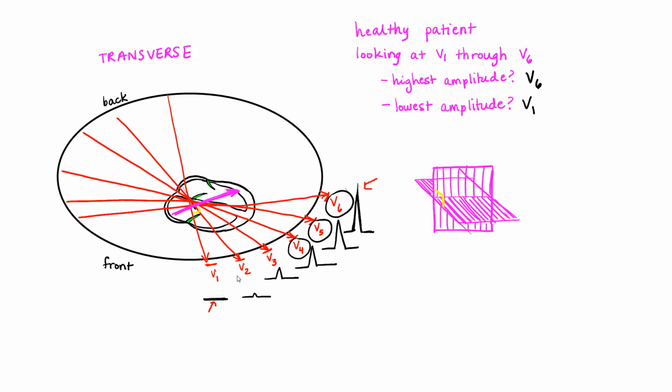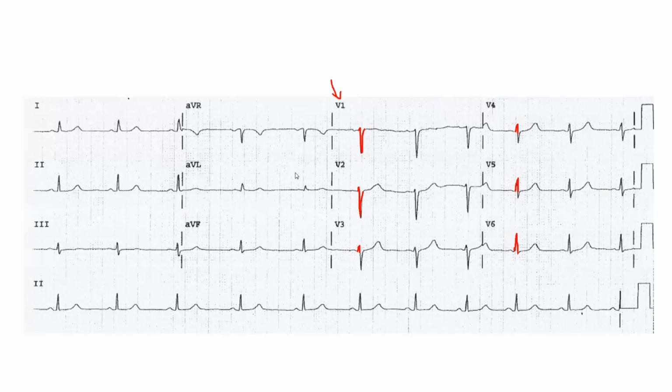And so we can assume that for our patient, the direction of motion of charge in the heart is going to be pretty similar to this pink arrow right here. And that is responsible for making our tracing look like this, at least in the precordial leads.